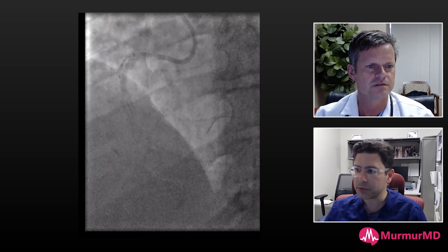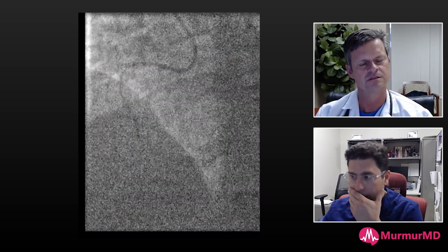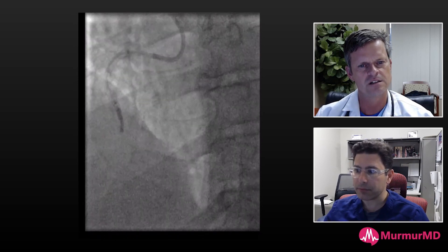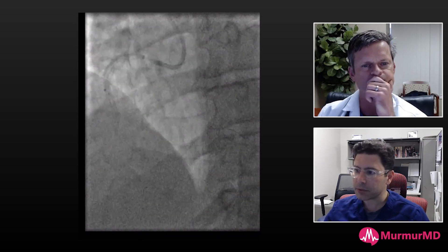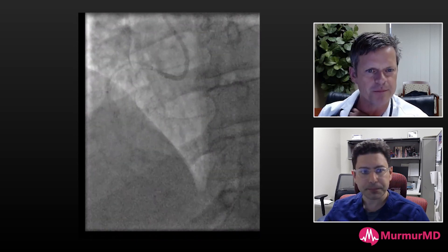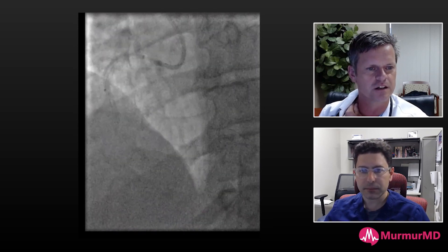At this point I wanted to pre-dilate and try to get a shockwave balloon. This is a 3.0 non-compliant balloon — you can see it's not really engaging the lesion, and that was the lesion that caused the problem in the first place. It wasn't prepped appropriately, and you couldn't prep it because you ended up with a distal dissection. You probably can't now because it's dissecting itself, so you're really stuck just needing to get stents across.